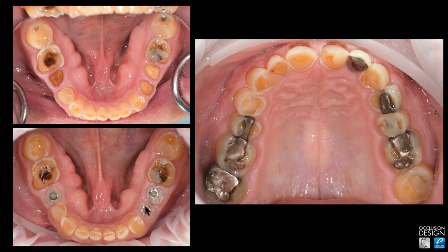So I sent the patient for a CBCT at Canarray here in Ontario. I use Canarray because it's just simple. It's a radiology clinic and group. They send me a report. They send me the case set up in Implant so I can plan out my implant placement and order a surgical guide. So I had Nahid consult with me on the implant placement and the design of where we were going to place them, basically subcrestally.